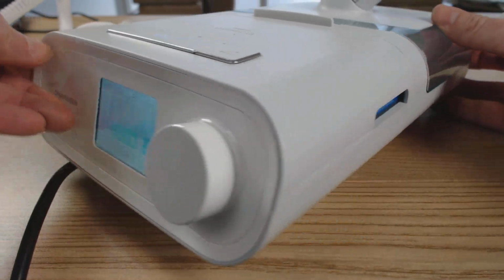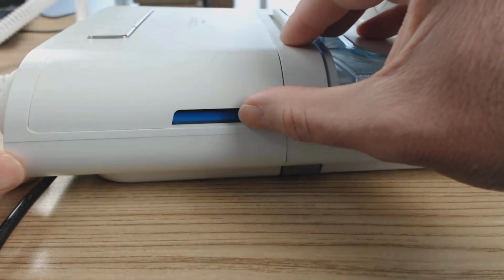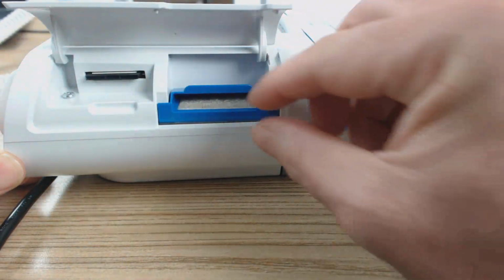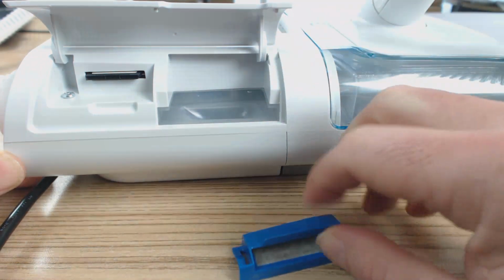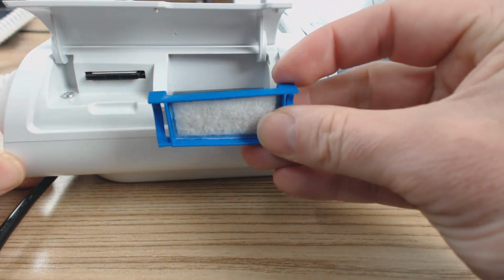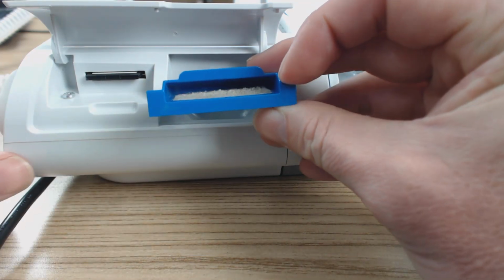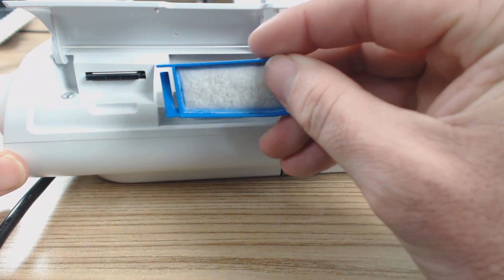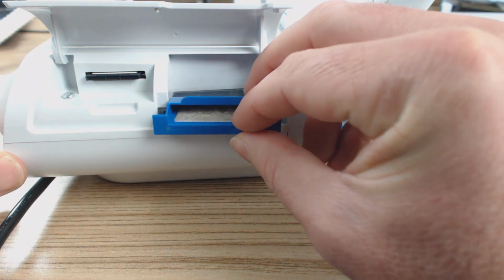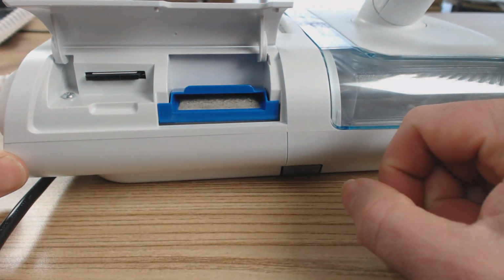So I'm just going to rotate this to the side here. You can see there's a little part here that we can lift up. Now here's your filter, it just slides straight out. Okay, so pull that out. Now these filters, this is the washable one. You can get another one that connects to the bottom, which is an ultra fine one. This one here, you can wash it, but you want to change it every 30 days. Okay, so every 30 days, get a new one and put it in.